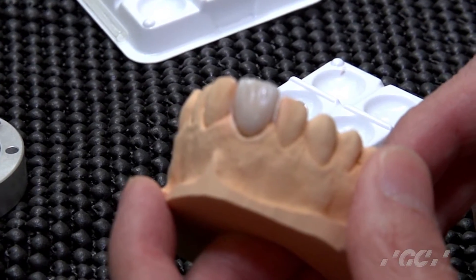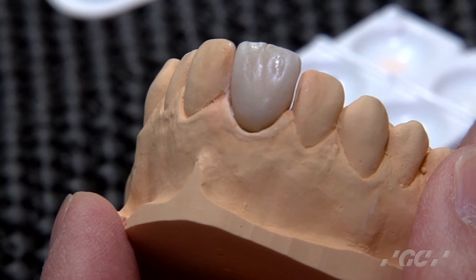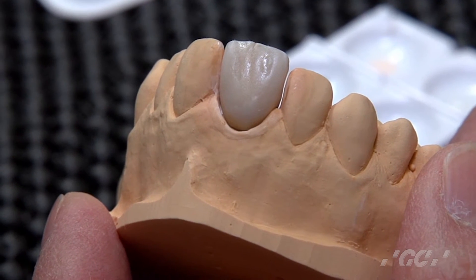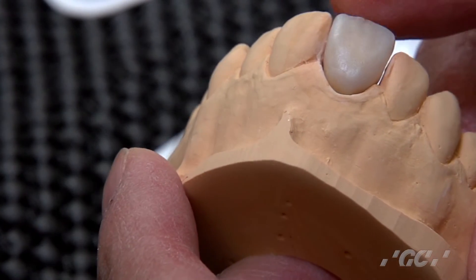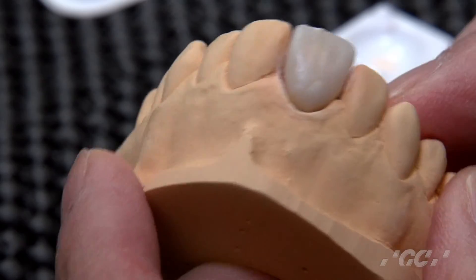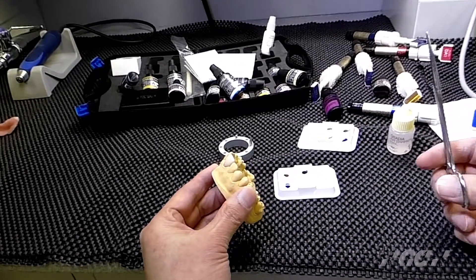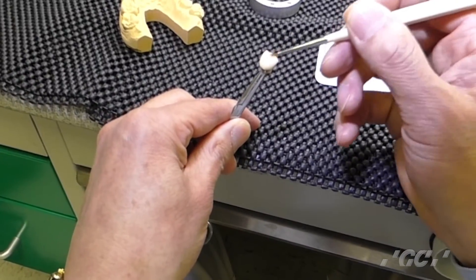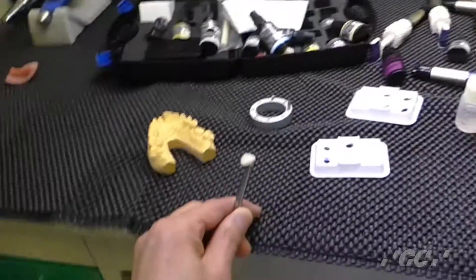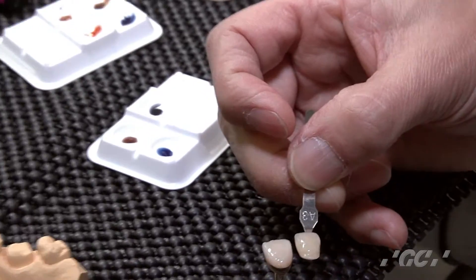Then remove the air barrier with brush and water. Reshape and contour it. After contouring, the crown came out like this. Next, ready for final stain. Apply a very thin layer of clear first, then try to match the A3 shade guide.